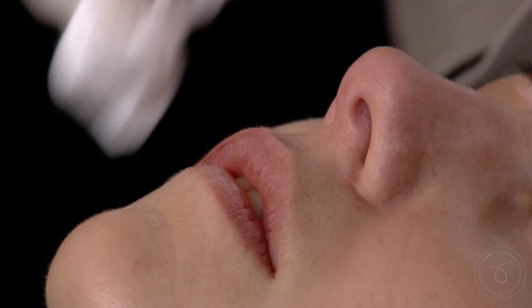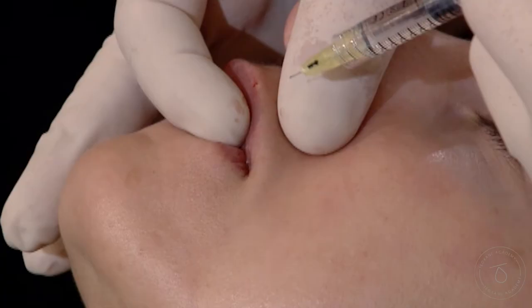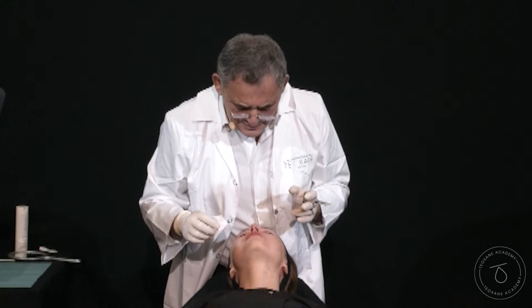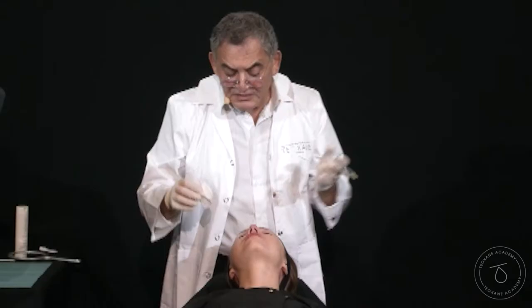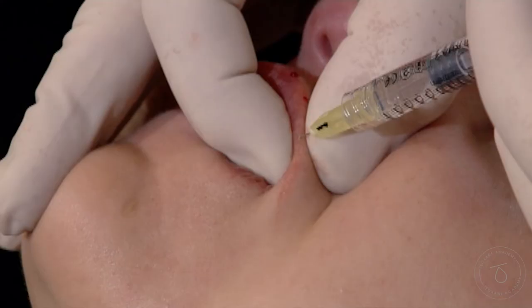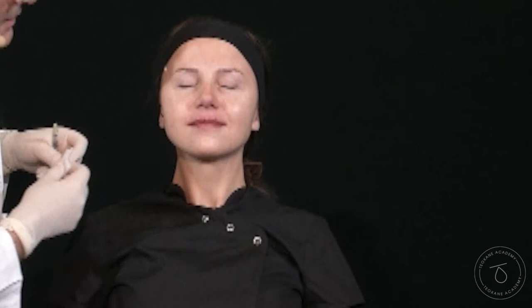The definition of the lip, I increase it. Can you see the outline? The whitening going all along the border. I press. Do you do sometimes some local anesthesia? I never use any local anesthesia — not even cream, not even EMLA. You can if you want, but I pinch the lip and honestly it's really not painful. I use this short needle. How many spots do you put on the lips? It depends the way I capture the virtual canal. Sometimes it runs all along in one or two dots.